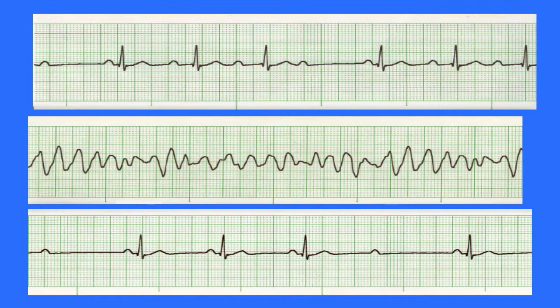On the next slide, at the top you have P waves, and the first P wave to the far left has a drop beat. But the next P wave conducts a beat with a fairly normal PR interval, probably 4.5 to 5 boxes, so normal. And then the PR interval on the next one conducts the beat, but the PR interval is long, and then the PR interval on the next one is longer, and then there's a P wave with a missing QRS complex, a drop beat.